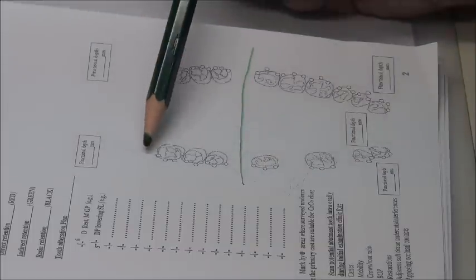So what other options do I have? Maybe combination clasps. So I could change to combination clasps. Okay. Combination clasp here, combination clasp here. What else should I do? What is the other change? حطينا الاريا مش او open lattice. Usually mesh في الانتيريور area لأنه upper. Okay. We put a mesh.